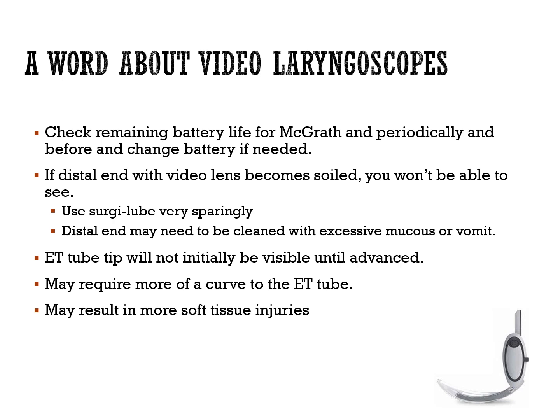You want to make sure that you check the remaining battery life. If it's a McGrath, it's a disposable battery that typically has 250 minutes. A UE scope would have a rechargeable feature, and a lot of the kind that have the remote monitor on a tower will have a battery, but it'll also be plug-in as well. So you want to make sure that you have adequate battery life, and if it's a plug-in, that it's adequately plugged in.